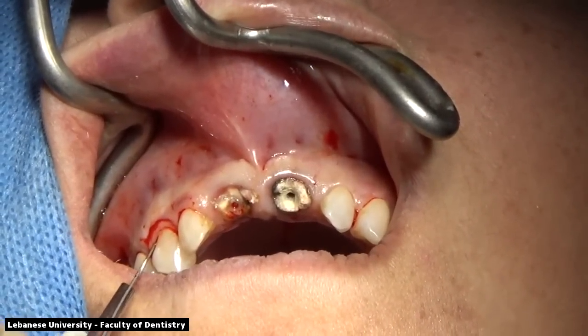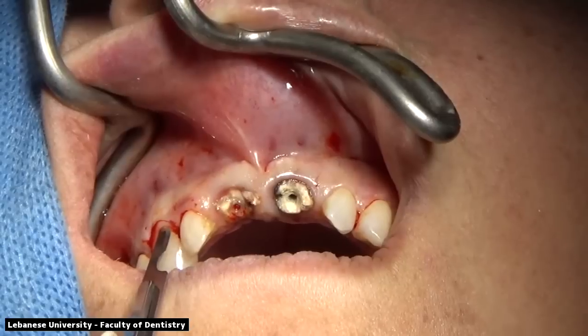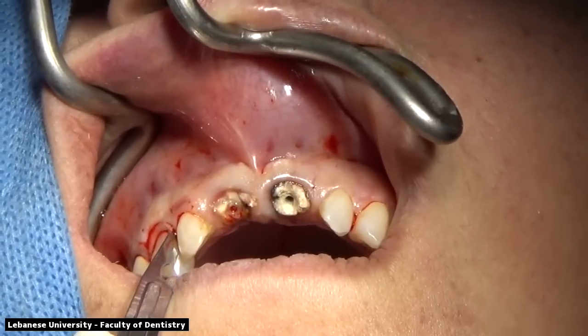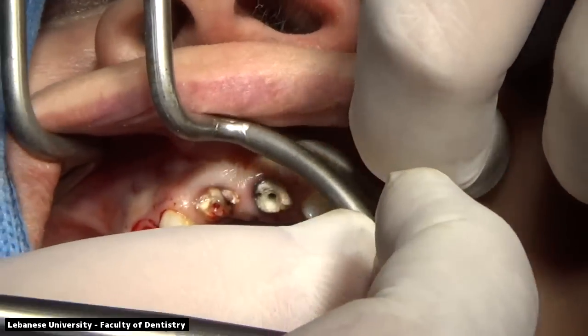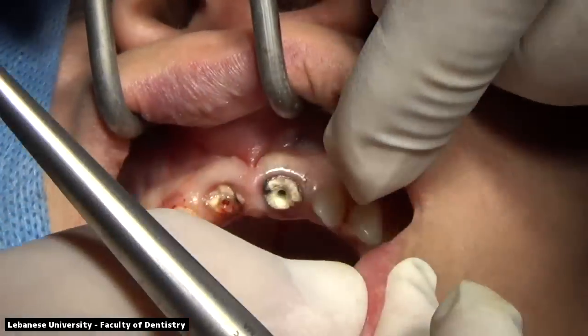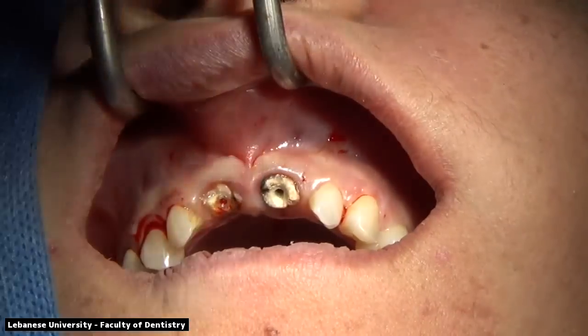So you can see that there is a distal zenith on this canine. It's not a straight line margin. The distal zenith is slightly distal to the midpoint of this canine, so the orientation is to the distal. When we go to the lateral incisor, we're going to be making a horizontal or flatter incision. There's no zenith position at this site.